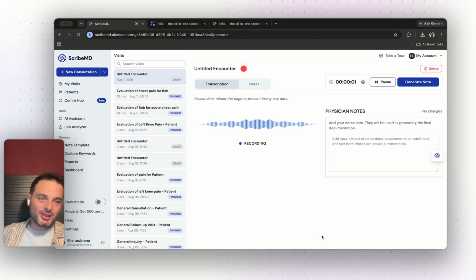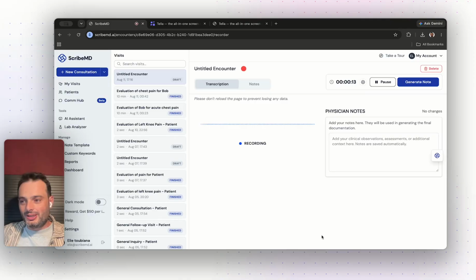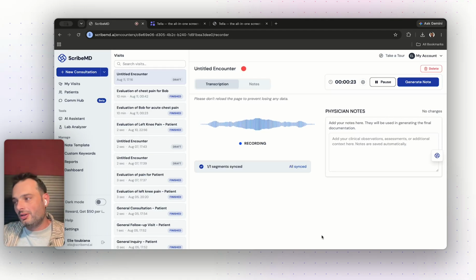All right, so please excuse my terrible acting skills. But let's say a patient walks in complaining of sneezing and a headache. Okay. And maybe the patient is saying they have a very bad headache, so I'm taking the temperature. It's 102.1.